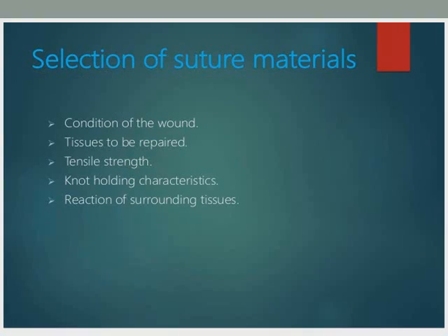Selection of suture materials. راح نختار ال suture materials according to condition of the wound, tissue to be repaired, tensile strength, knot holding characteristics, reaction of surrounding tissues.